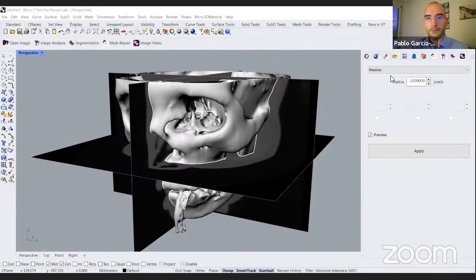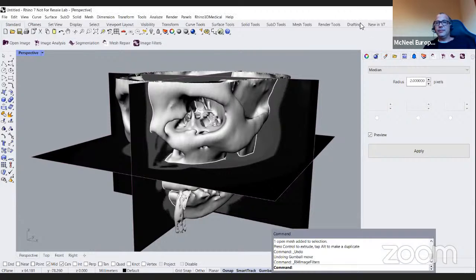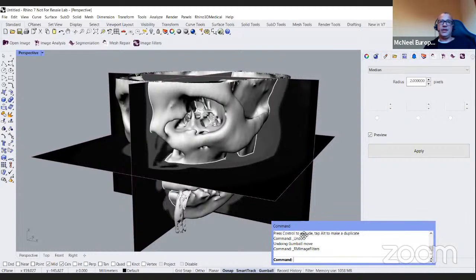Cool. Related to this, Isaac Watso says, okay, great software. Does it work volumetrically through voxels, similar to Grasshopper plugins like Dendro or Axolotl? Can you repeat the software? Yeah, if it does work volumetrically through voxels, like the Grasshopper plugins Dendro and Axolotl. I think he's asking if what you have later are voxels and you can work directly with voxels. I think that's only part of the conversion to meshes, but later you are not working with voxels, right?